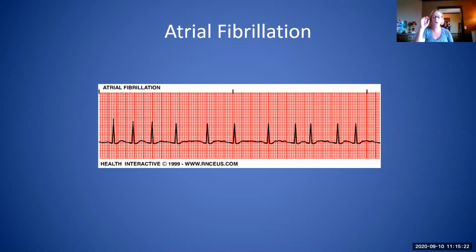So what happens is you hook the patient up to the defibrillator. It's still the same machine, and you synchronize it, and you make sure that when you charge, which you usually don't need to use as much energy for cardioversion, you charge it to usually about 100 joules, and you sync it. When you sync it, that machine puts little tick marks, like a little arrow above every single QRS. So that way you're telling the machine that is where you need to shock the patient and nowhere else. Then when you hit shock, it won't deliver immediately. It'll only deliver as soon as it reaches one of those arrows. So it'll only shock them on the QRS, so you don't risk accidentally shocking on the T wave.